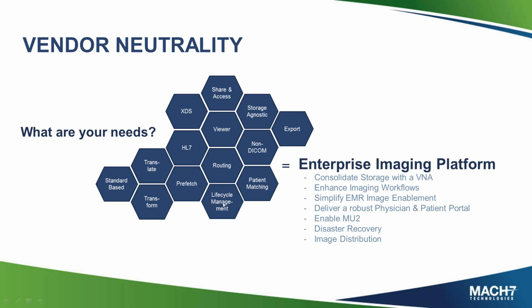Another core component of a vendor-neutral archive is lifecycle management. One thing I'd highlight here is that lifecycle management is not just about purging data. The lifecycle of a study is about: I received this study and I stored it on this storage device, and in 2 years I'm going to move it to this other storage device, which costs a little less money, although it may be a little slower.